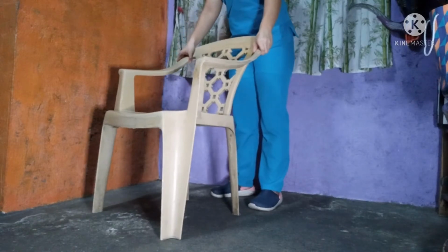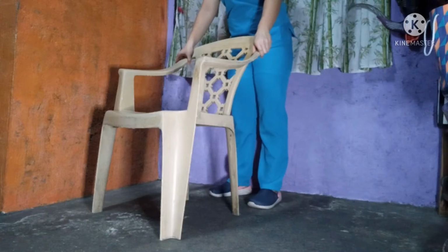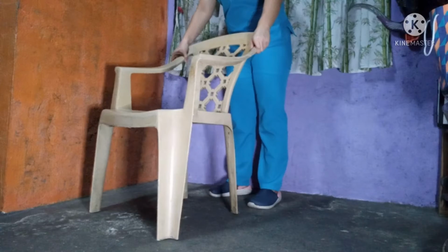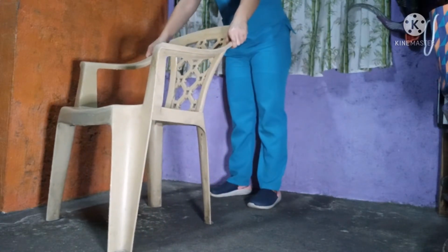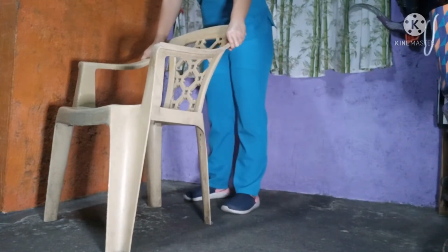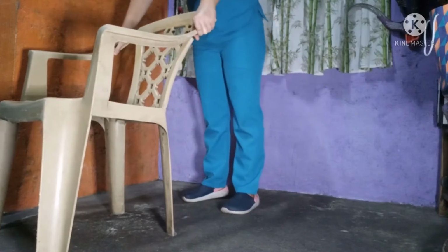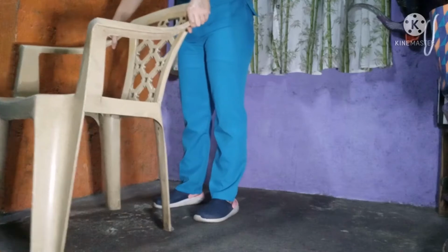The patient will lift and move the walker forward. Make sure all 4 tips of the walker's legs are touching the ground after moving the walker forward before proceeding. Then the patient will move the weak side forward, putting weight on the hand grips via the hands. Then the patient will move the strong side forward.